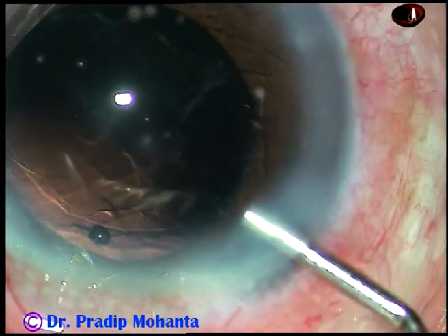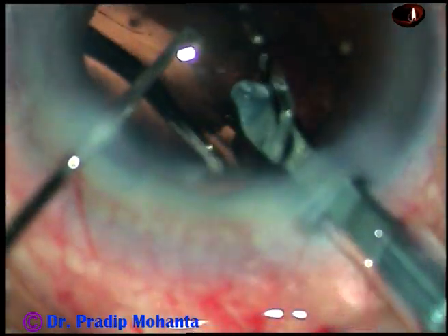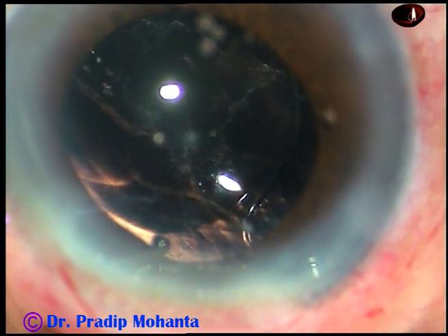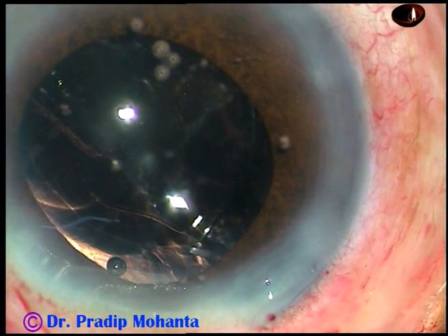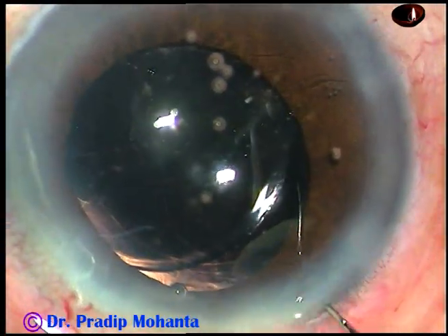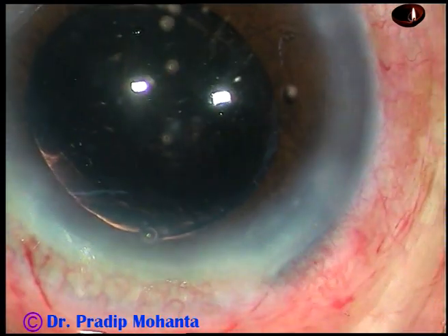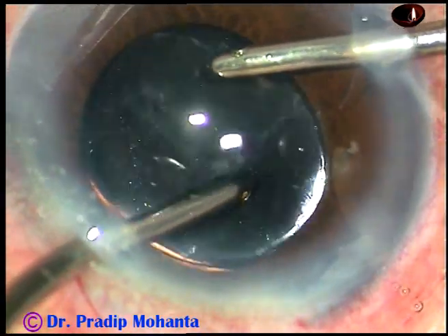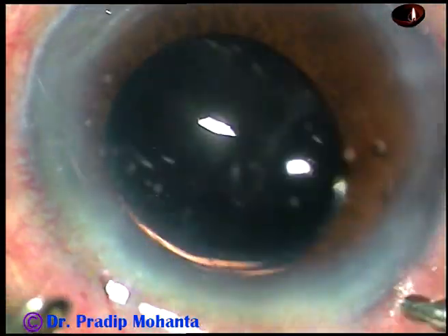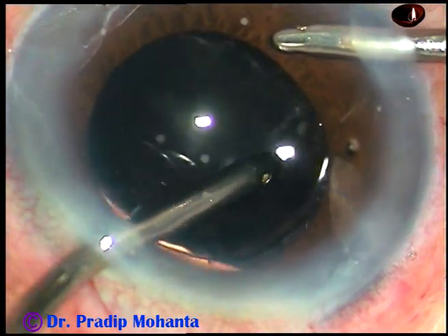After removing the cortical matter, I have injected viscoelastic substance, and here goes the intraocular lens — this is Supraphove from Appa Sami Associates. I have been using this lens for the last three years; the PCO rate is negligible. No financial interest — the company will not pay me anything for saying good words about this lens, though I am very grateful to Appa Sami Associates for all their past help. But this lens is really good and I am very happy with it.